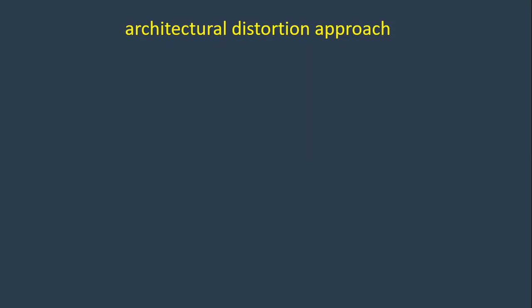And if the patient has previous mammograms, we compare. Then we can go for further imaging, like ultrasound, for example. If it's not conclusive, then we can move to MRI.